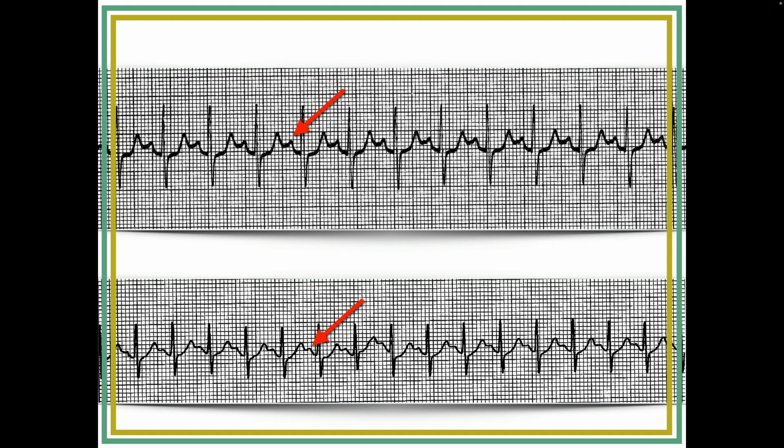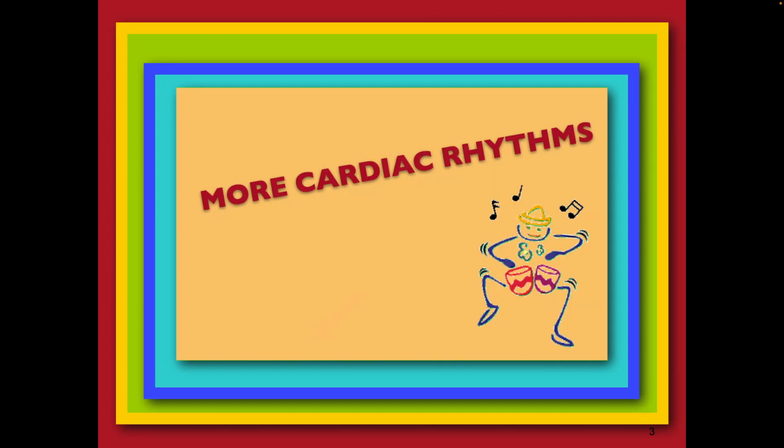And the logical conclusion to that, and it does happen, if the rate gets fast enough, what do you think happens? If it keeps moving together, the P wave is moving toward the T wave. Well, they'll kind of just get buried in the T wave. In fact, the P waves will completely disappear because they'll just move right into the T wave, okay? So that's just a handy thing to know, and we're going to need to know that today. So I'm just pointing that out.